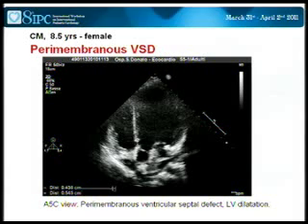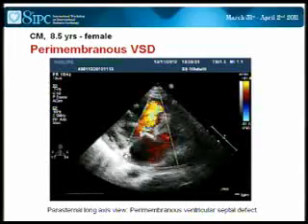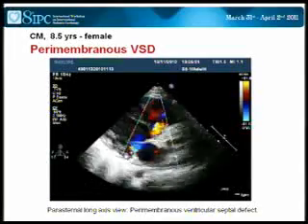Yeah, Carmelo and Jacques. Well, the question is whether, Kevin, I'd like to know your comments about the diagnosis of perimembranous versus high muscular VSD. Yeah, they've got some really nice echo pictures of it. And I think there's a nice short axis view on the TTE that is fairly convincing for it being a perimembranous defect. So, Carmelo, why don't you show us the video clips of the echo? Can we just have the live echo pictures, please?